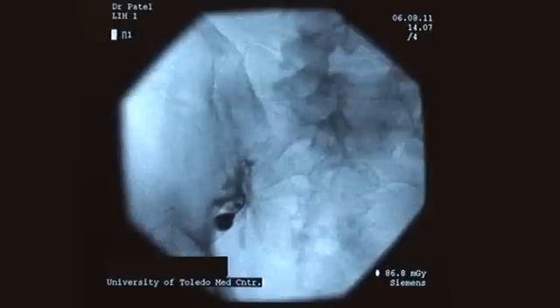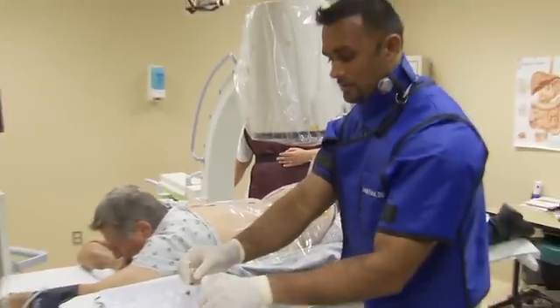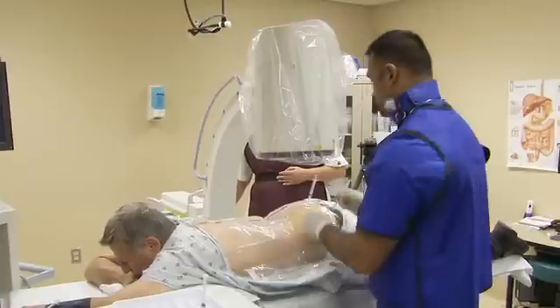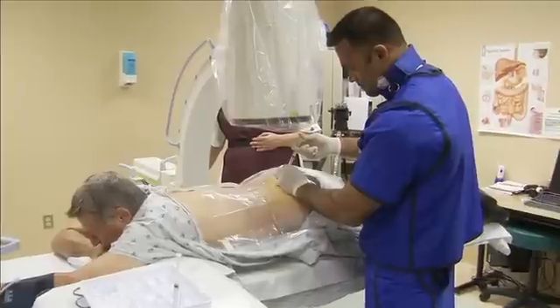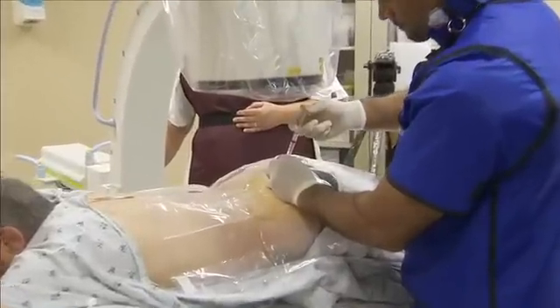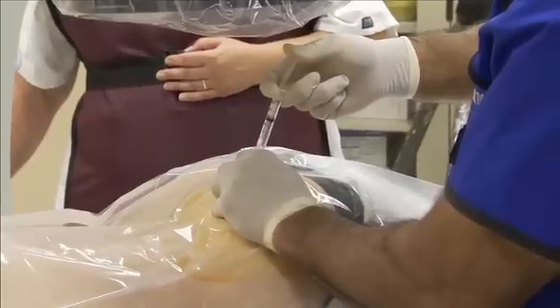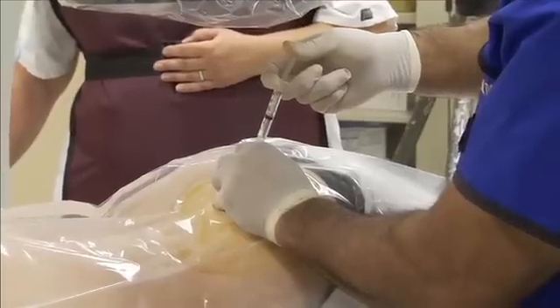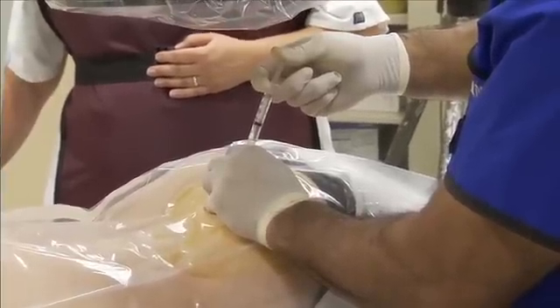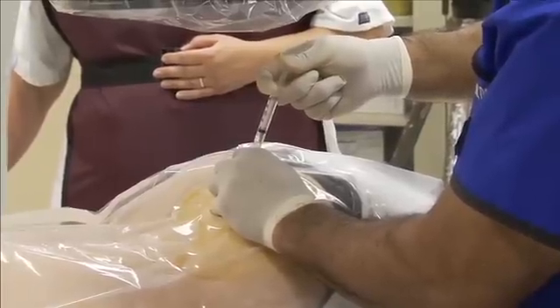At this point, I don't want to inject any more contrast — I want to go ahead and put the numbing medicine into the joint, and we're going to inject about 1.7 cc's of anesthetic. For diagnostic injections such as this, up to 2 milliliters of local anesthetic may be injected. For therapeutic injections, 0.75 milliliters of the steroid of choice and 1.25 milliliters of 0.5% Marcaine would be used.